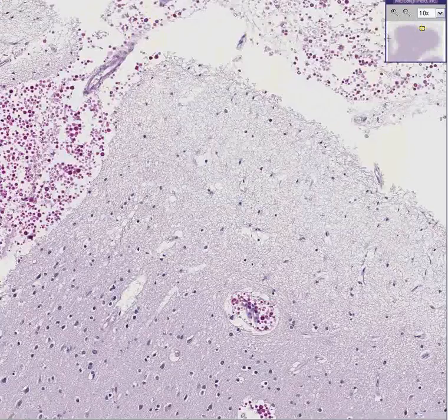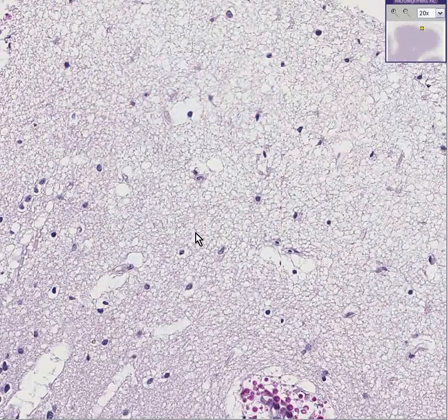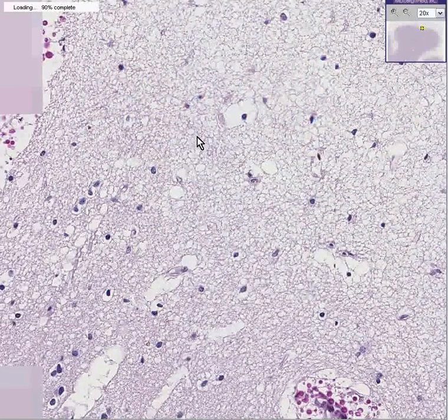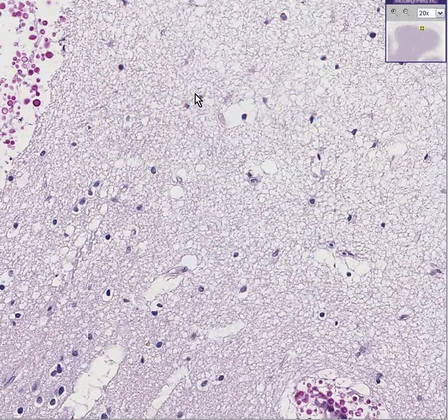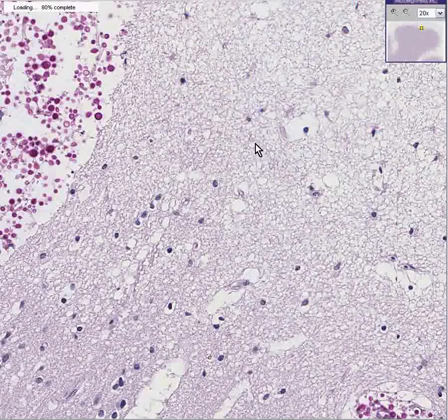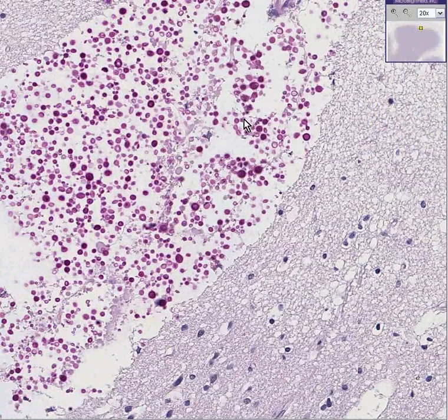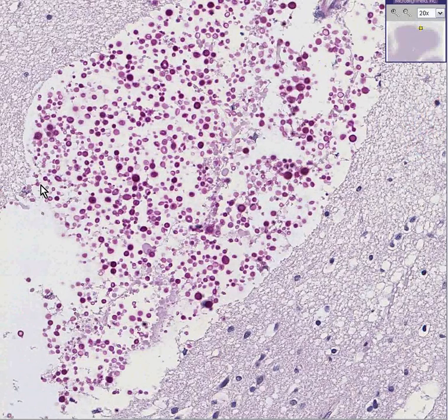Notice that you can see the nuclei of cells within the brain substance nicely, but the cytoplasm appears washed out because instead of eosin, they used another stain called PAS, which loves to go to fungus. It not only goes to fungus hyphae, like we saw with the mucormycosis case, but it also stains fungal yeast forms.